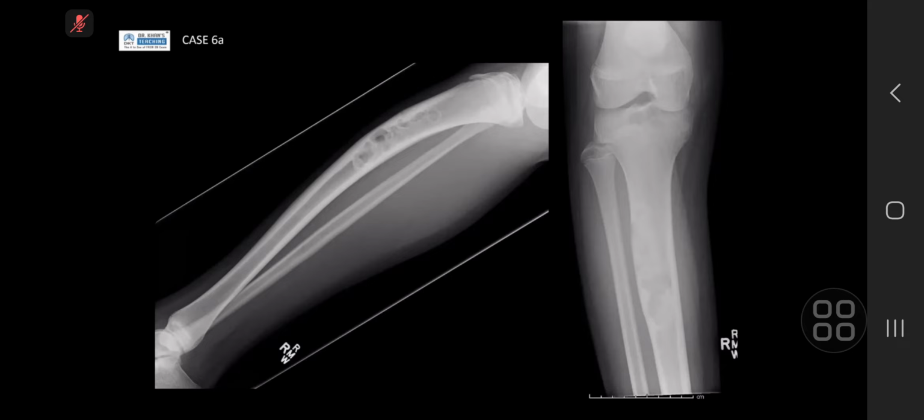So it has caused a bowing of the tibia, or the patient inherited the skeletally deformed bone. I would say the lesion is non-aggressive because I cannot see any periosteal reaction or soft tissue swelling. There's a narrow zone of transition. I can see the inferior lateral borders, the inferior medial borders, superior borders. Yeah, good. Okay, so you're not seeing any aggressive features.